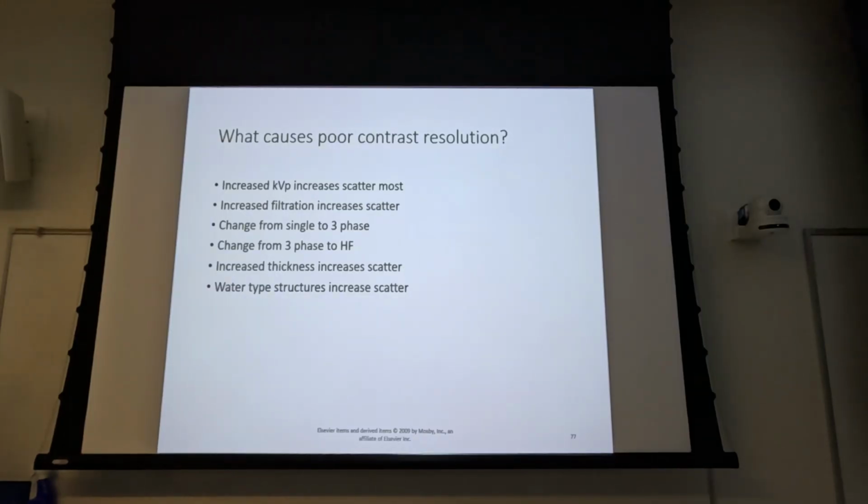So if you were to shoot, you use your 15% rule and increase your kVp by 15%, reduce your mAs by a factor of 2, you put those two images side by side, you're not going to see a whole lot of difference between them, right? Maybe even if you did it twice. So I talked about the evolution of technique as we went from screens and films to CR.